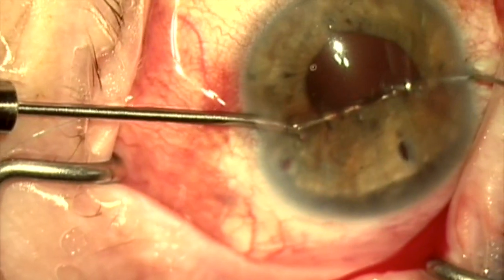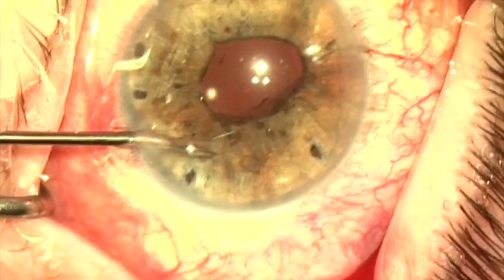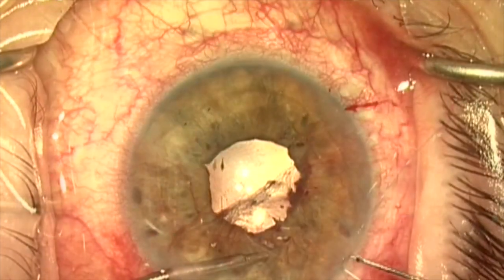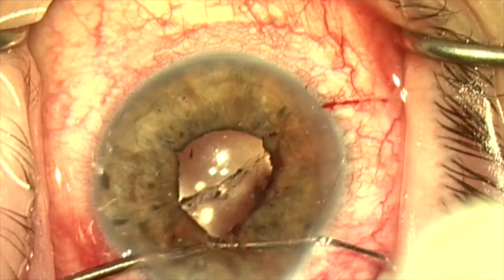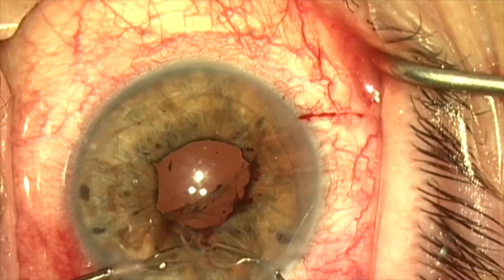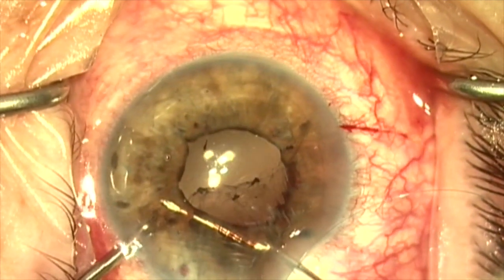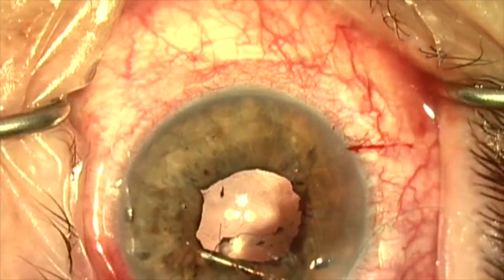Here I'm grabbing the suture and pulling it out of the hypodermic syringe, backing the syringe out, then pulling the suture out of the paracentesis with 25-gauge forceps to continue the cerclage. I reload it into the 33-gauge needle for my last 90 degrees of suturing. I've reentered through the paracentesis and am stabilizing the iris with the left hand while suturing with the right. This is actually a little more difficult than a baseball stitch, but I chose it because the iris sphincter was functional and round and I did not want to distort it — I just wanted to limit dilation to prevent optic capture.